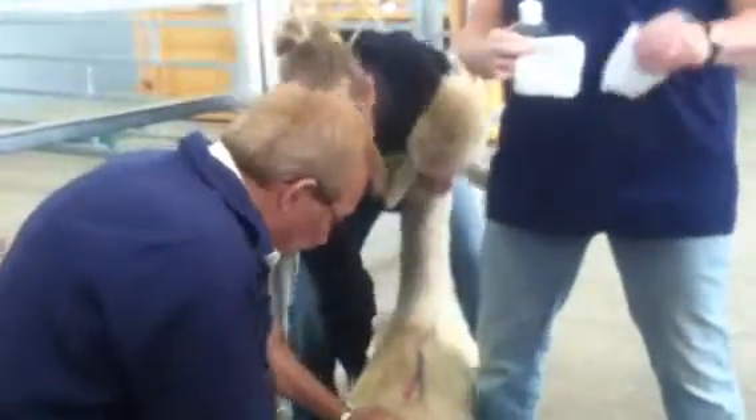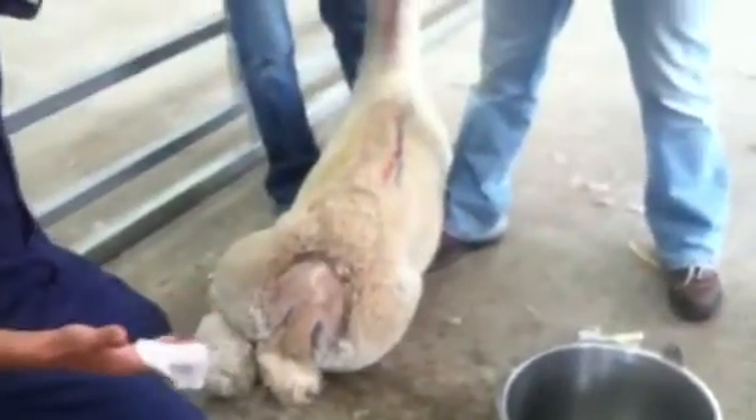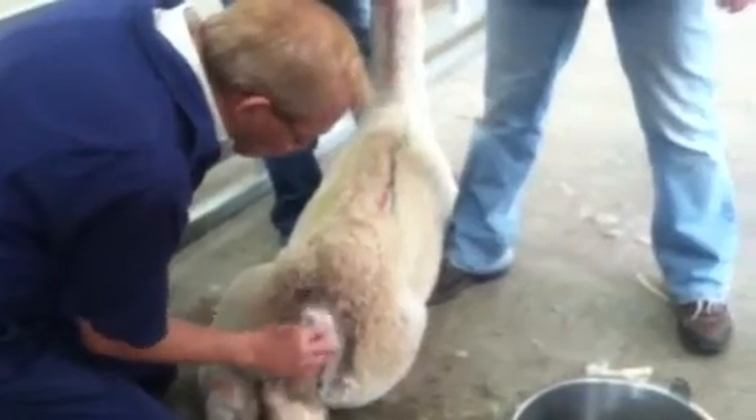Once you've gone out, you don't come back in. You go middle to outside, you don't come back in. And you shouldn't use this hand. In livestock, you grab with your clean hand and transfer it to your dirty hand. You don't want to take this and contaminate the water. There's a whole bunch of stuff to keep in mind.